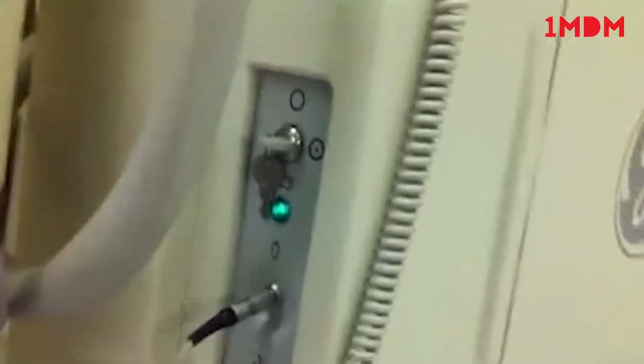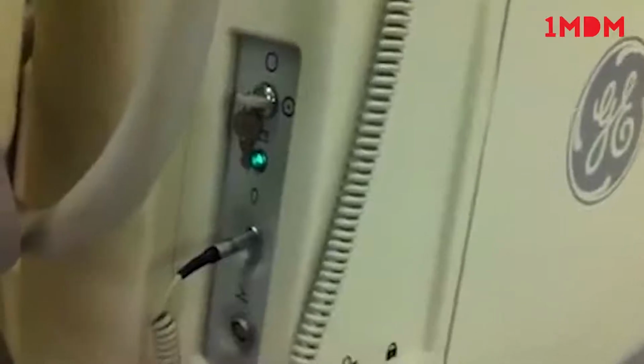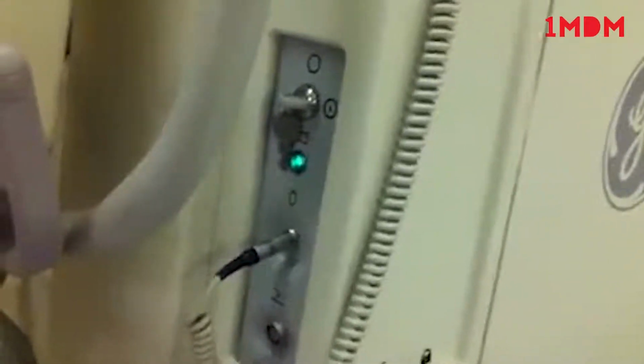Now you want to leave the machine plugged in, particularly after you do an exam, because you see this little light here next to this key. You want the machine to charge its batteries. If you regularly just unplug it after you finish the exam and store it without it being plugged in, eventually it can damage the battery packs, and it can cause other damage, like damage to the charger, because the battery cells are ruined or dead, and a host of other problems. Something just to be aware of. Other than that, the C-arm is parked. It's ready to go for tomorrow for another exam.